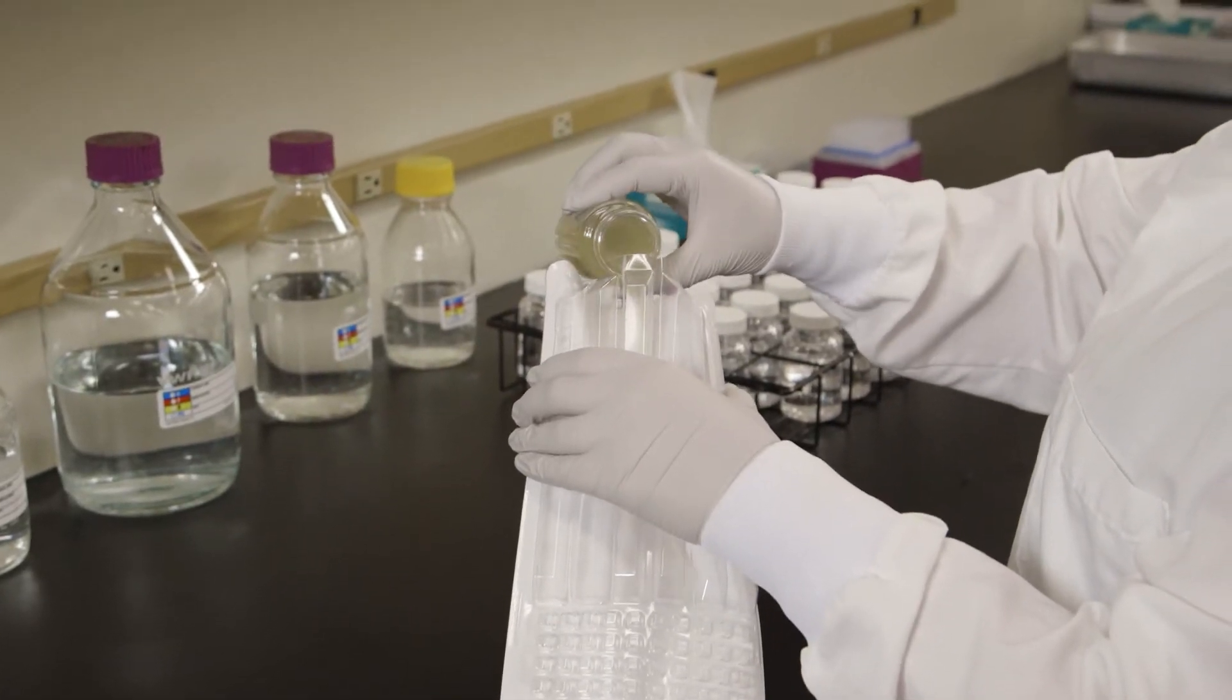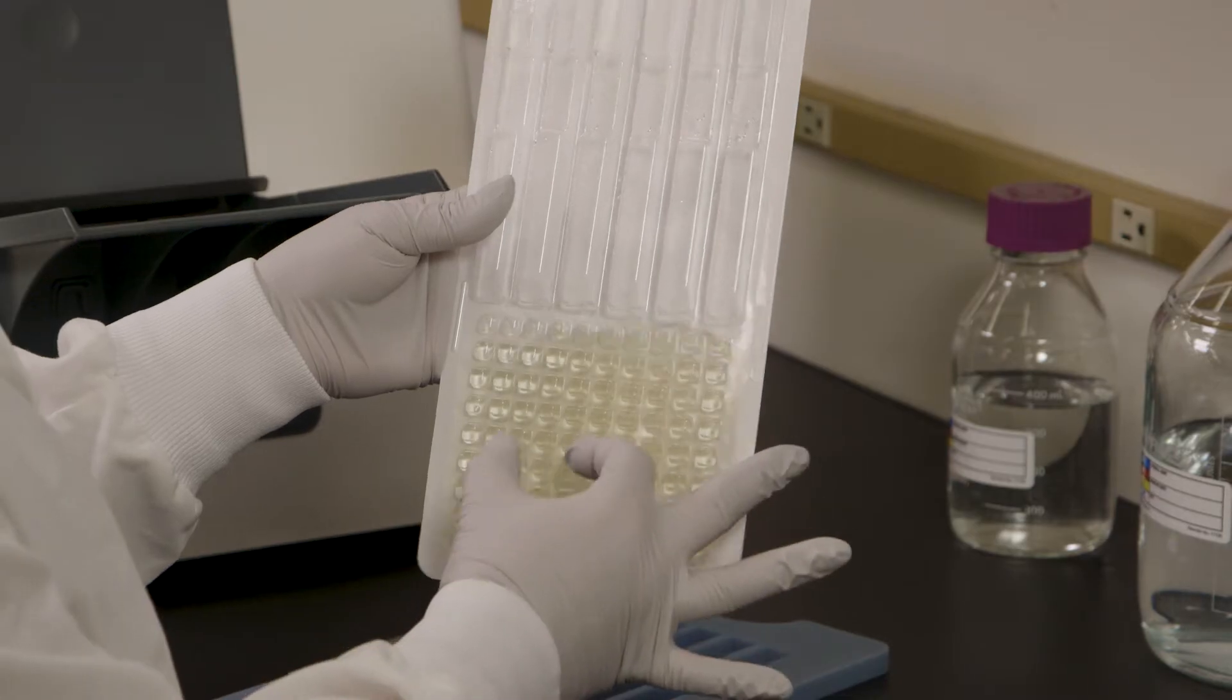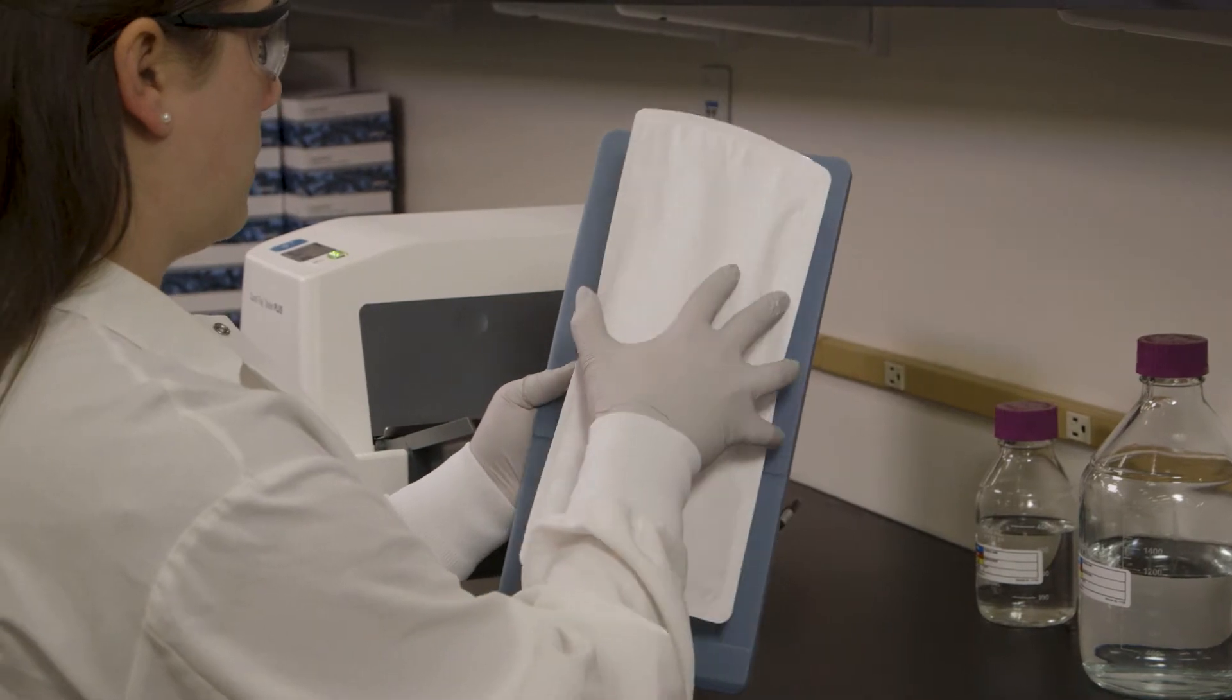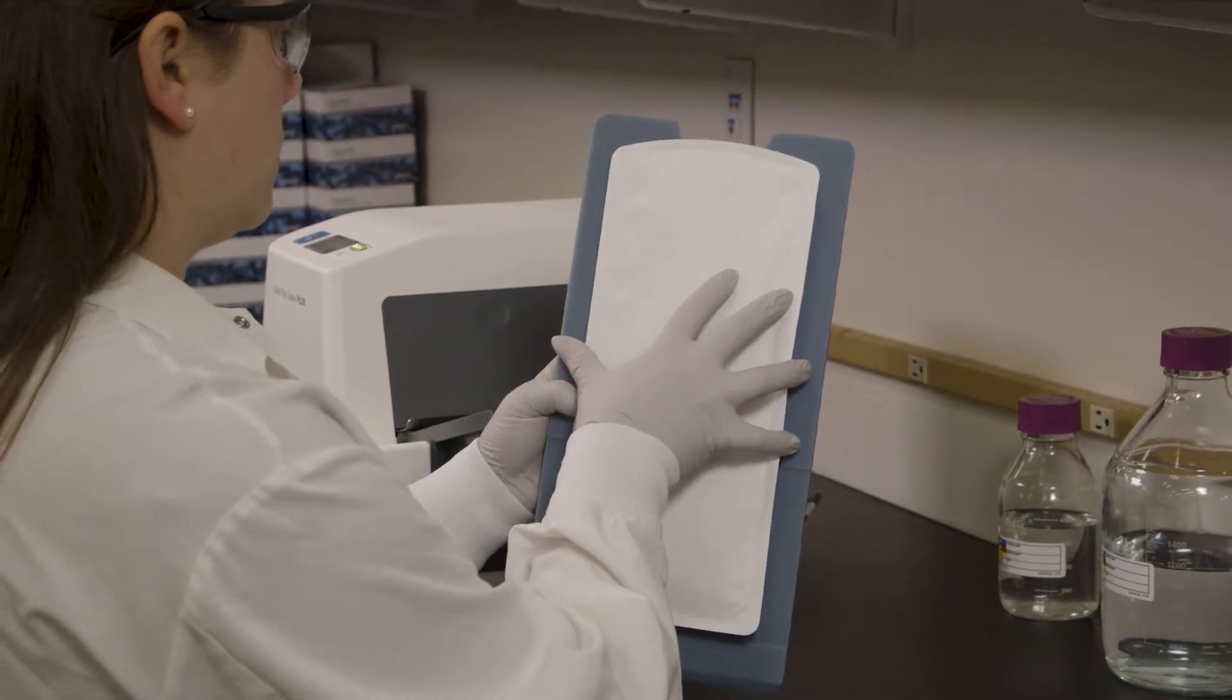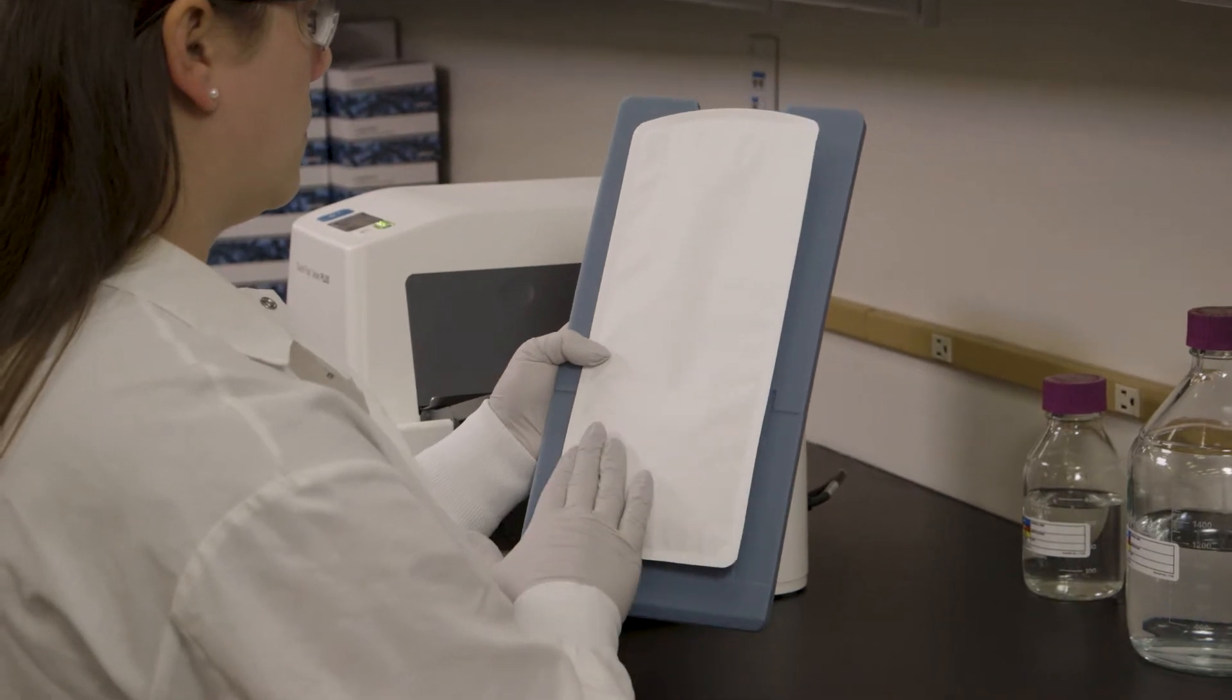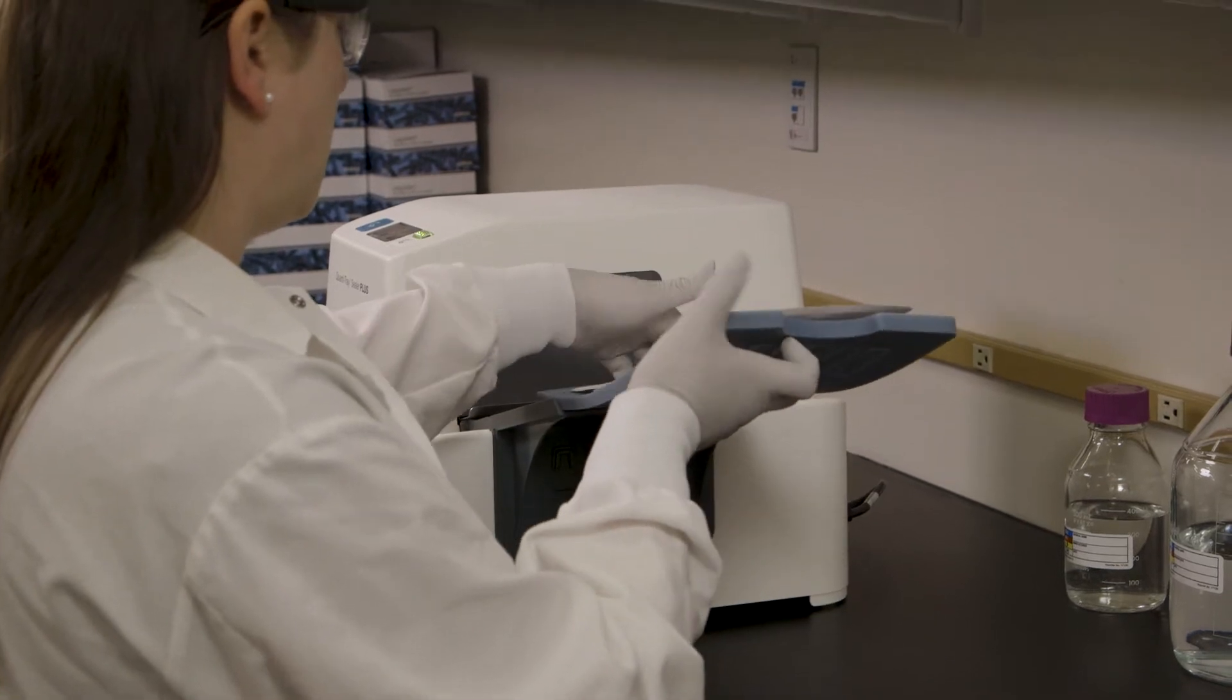Aseptically pour the sample mixture into the tray. Tap or flick the tray to remove air bubbles. Immediately place the filled tray on the rubber insert, making sure each well fits its corresponding hole. Push the insert with tray into the sealer until the sealer grabs the tray and pulls it into the slot.